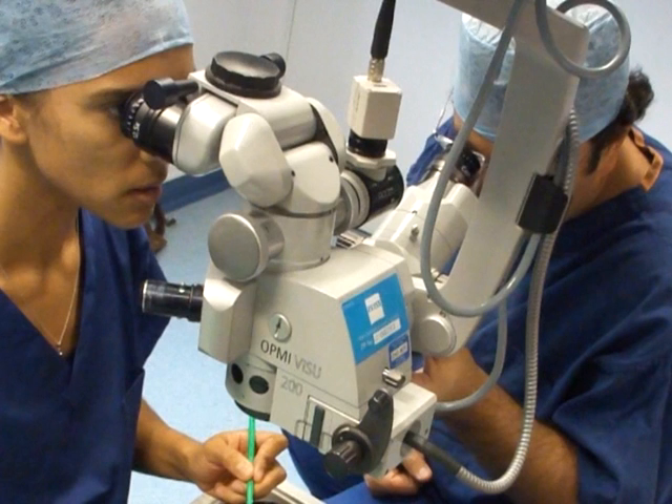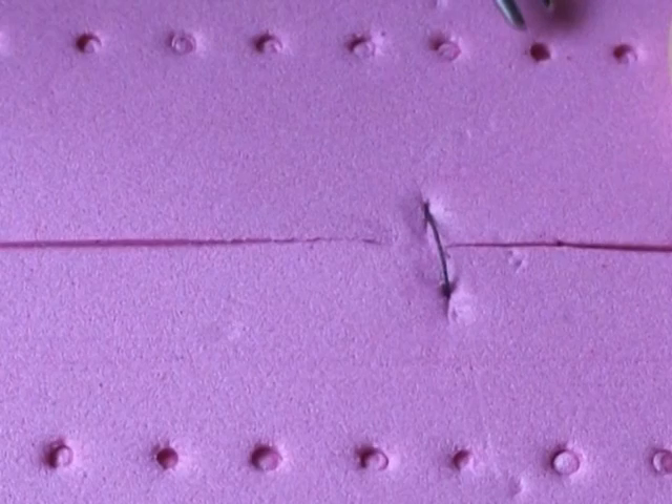For this, we use an operating microscope, and 10-0 monofilament nylon is the standard suture that we use for corneal or corneoscleral suturing. The main difference is that the knot must be buried inside the tissue, and not left on the surface.